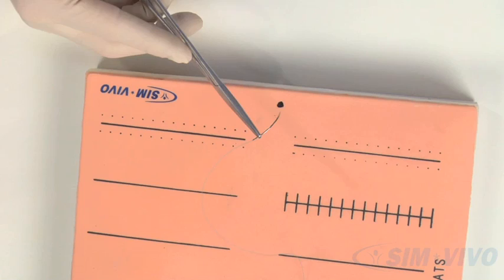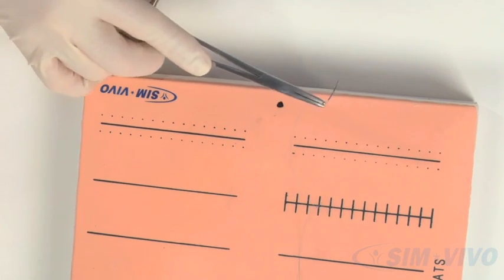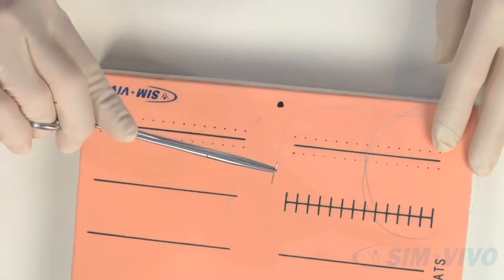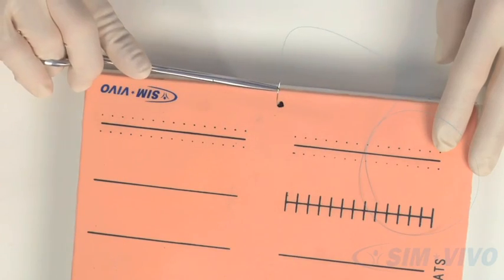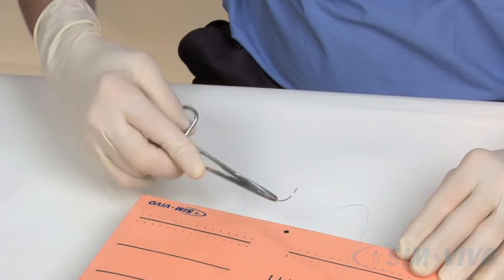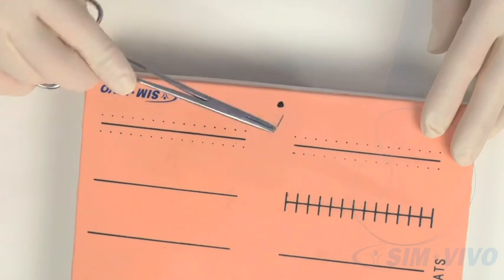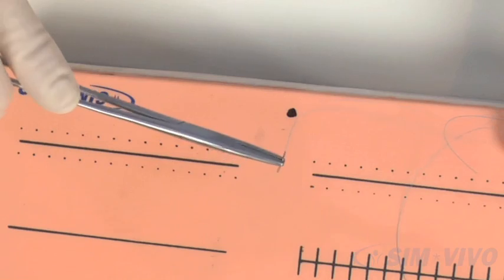The basic motion for suturing is an anterior rotation of the wrist towards you. The wrist starts in the prone position and supinates towards you. We will always try to enter the skin or fascia at a right angle and exit at a right angle. This requires a rotation of the hand to follow the curve of the needle. Practice this supination motion a few times in the air. Do it smoothly. Use the full range of your wrist mobility.